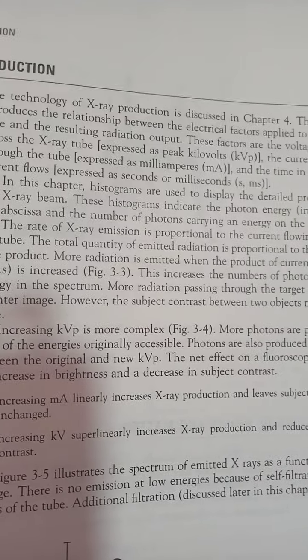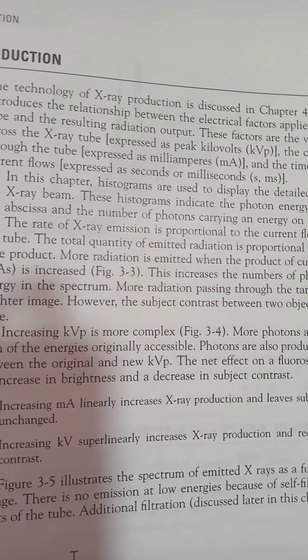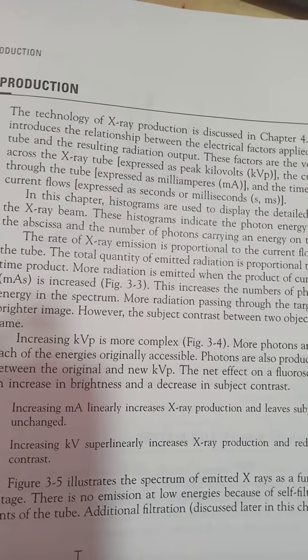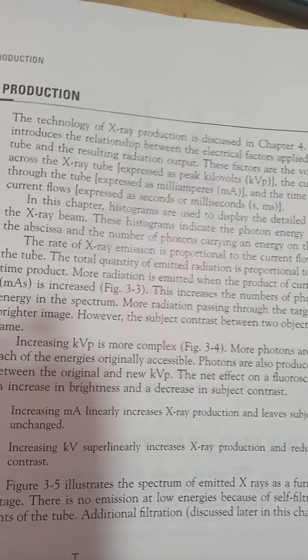one of the other things is eddy currents, internal heating, and the circuit heating, in vacuo, impedance, reactance, and issues generated due to inefficient inductance.